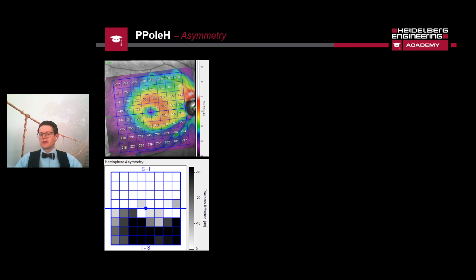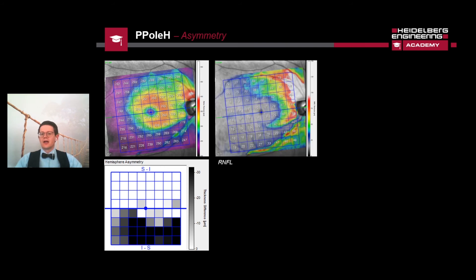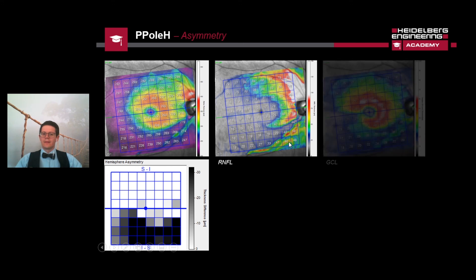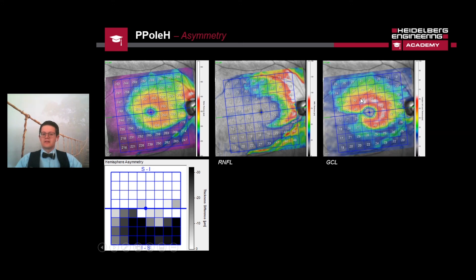Moving from the optic nerve head to the macula, the asymmetry analysis clearly shows the nerve fiber bundle defect visible in the posterior pole map and in the hemisphere asymmetry. In the segmentation of the RNFL and ganglion cell layer, we see very warm colors on the superior part and less warm colors on the inferior part, meaning those areas are way thinner than the ones on top. The ganglion cell layer shows the same finding — we don't have the donut- or bagel-shaped pattern we would like to see, and there is notching on the peripheral position that we don't want to see in healthy eyes.